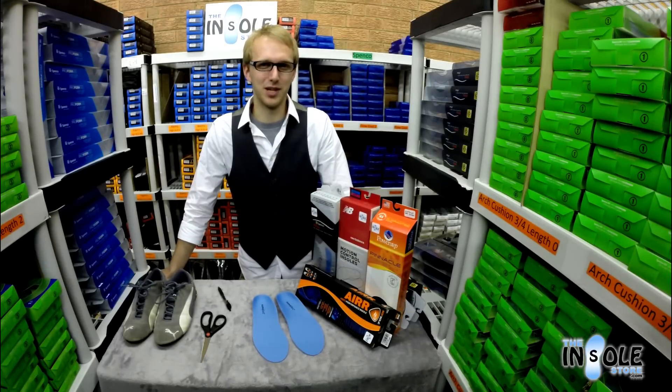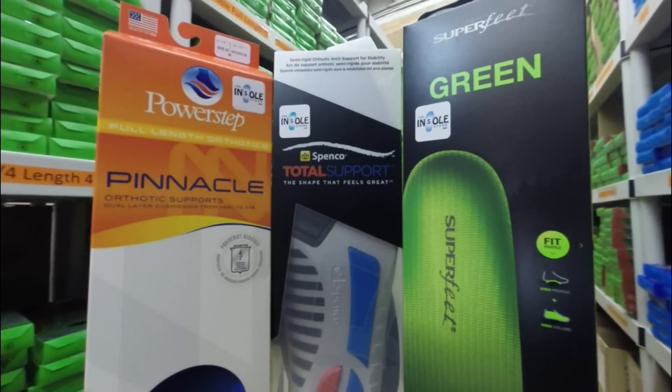Hello and welcome to the insolestore.com. Today we'd like to take a moment to show you how to trim your new full length insoles.